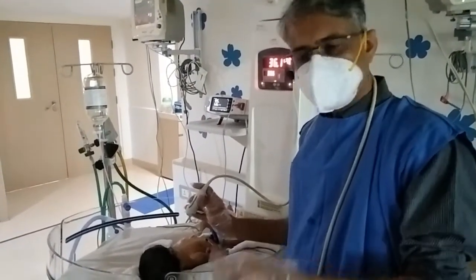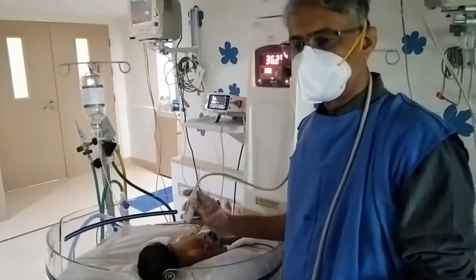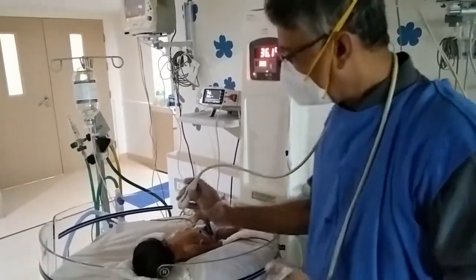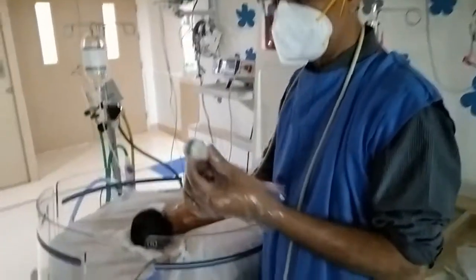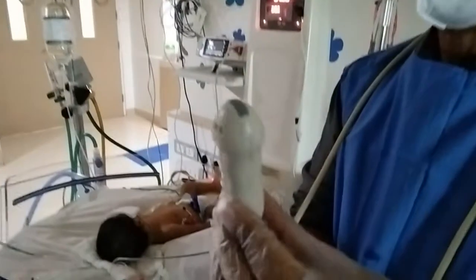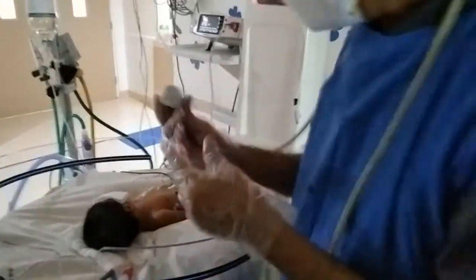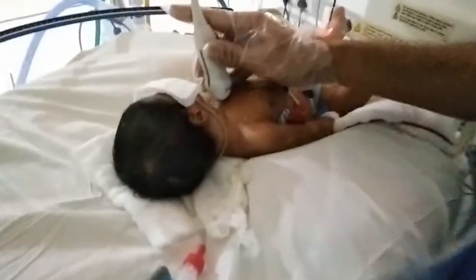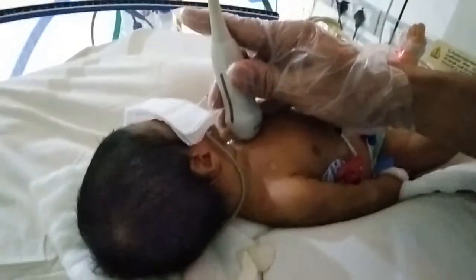For that purpose, a thymus ultrasound was performed. The probe placement for the thymus: this is the curvilinear probe with a frequency of C8 and 5, and this is the position where I keep it just below the suprasternal space, tilting to the right.